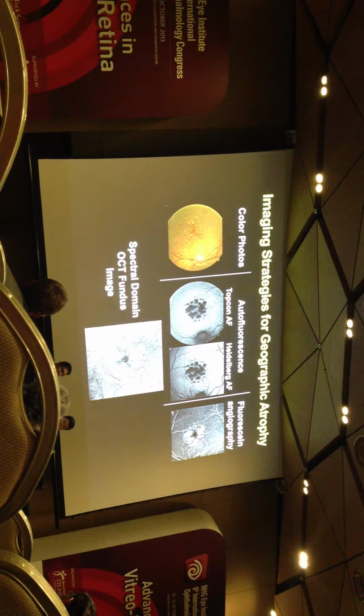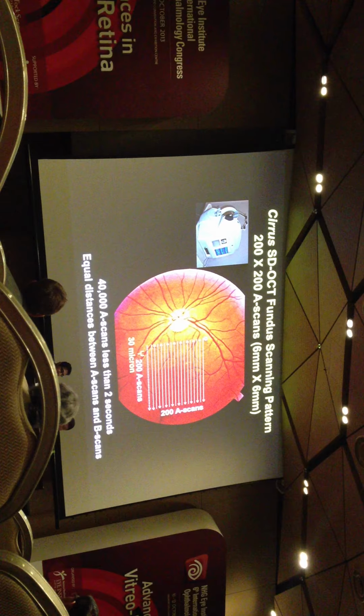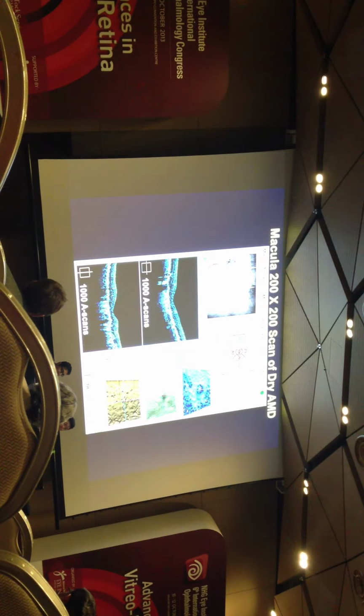But we've been using spectral domain OCT fundus imaging, which is an en-face imaging strategy, to follow patients with geographic atrophy. And again, we're using this exact same scanning technique. I like the scanning technique because I do it on all my patients, whether they're dry or wet, and it allows me to go back and look at different algorithms because I always have the exact same scanning technique. Okay? So the OCT fundus image is up here. That's an en-face projection image with the Cirrus printout.